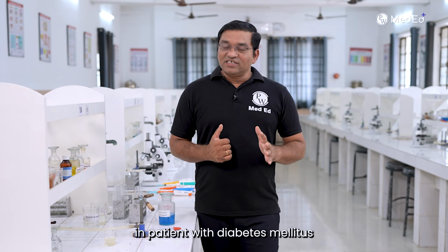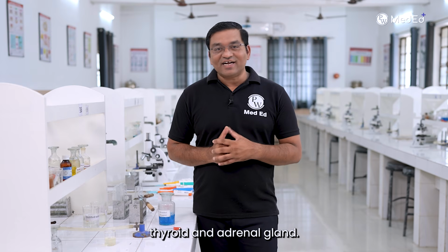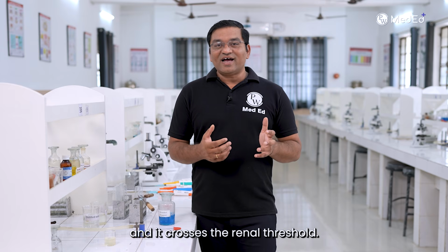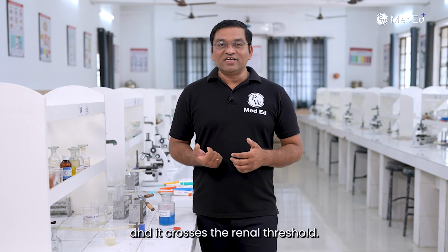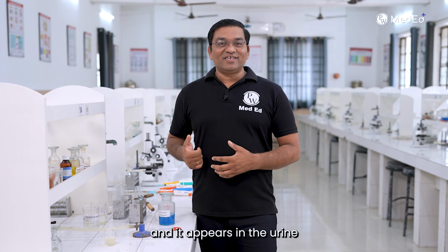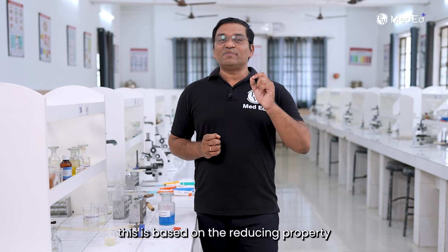In patient with diabetes mellitus and in some hyperactivity of pituitary, thyroid and adrenal gland, the reducing sugars, particularly glucose concentration, increases in the blood and it crosses the renal threshold. The renal threshold is 180 mg per deciliter and it appears in the urine and it is detected by this Benedict test. This is based on the reducing property.